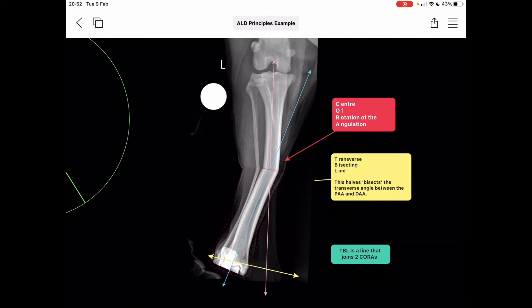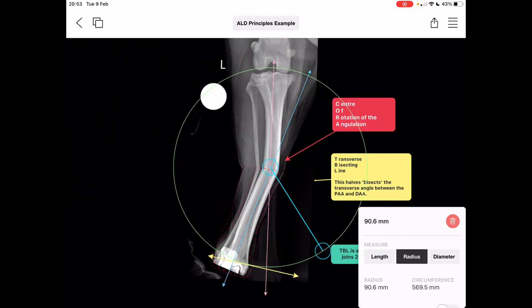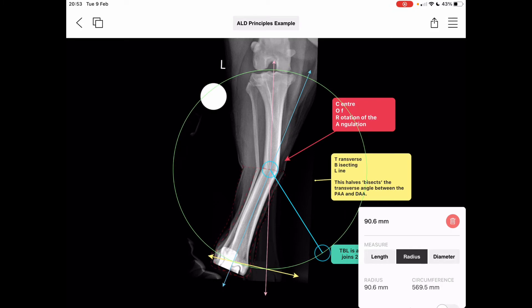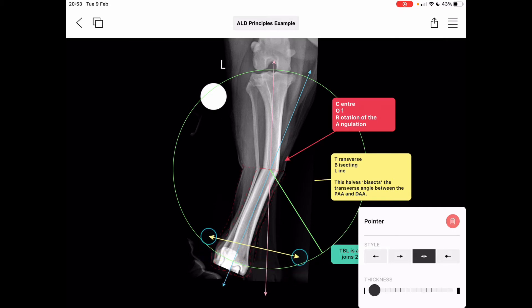In this next slide, we're going to introduce the transverse bisecting line. This is the line that precisely halves, or bisects, the transverse angles created by the extension of the proximal and distal anatomic axes. There's a very simple, precise and efficient way to demarcate this transverse bisecting line with the VPOP tools: center a circle on the neutral CORA, place a line across the circle's intersection of the proximal and distal anatomic axes, then simply slide or pan the line up in VPOP to meet the neutral CORA.